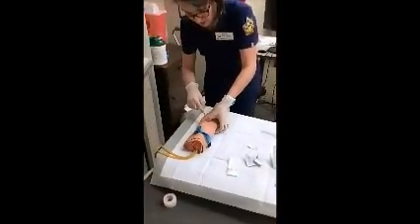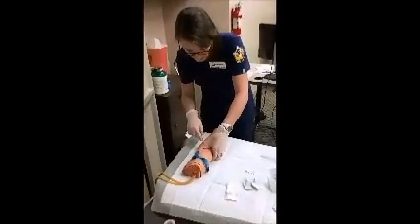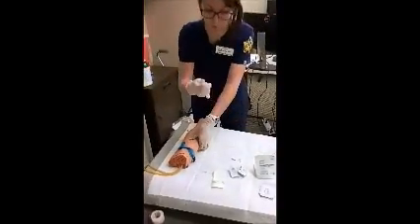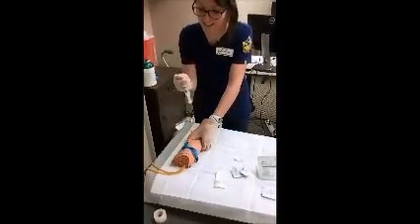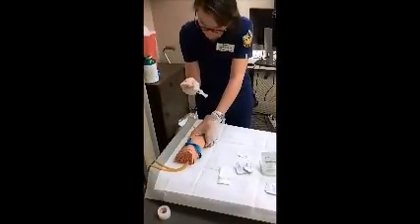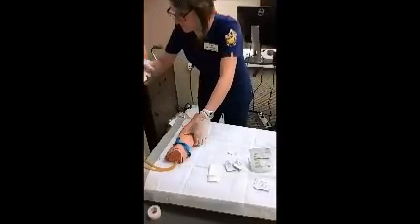Now, here comes the fun part. We're going to find where the tip of the catheter is and go just above it and pinch the vein while we're removing the hub. And with one hand, I'm going to pop off. There we go. Pop that off.